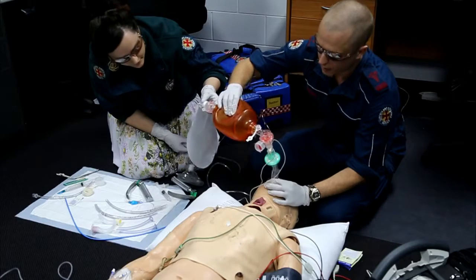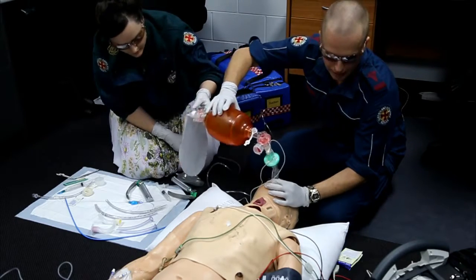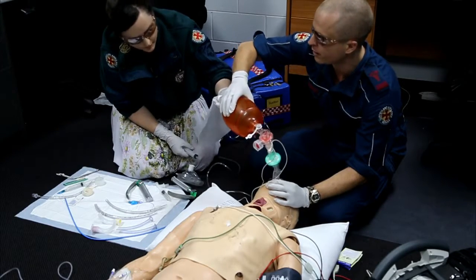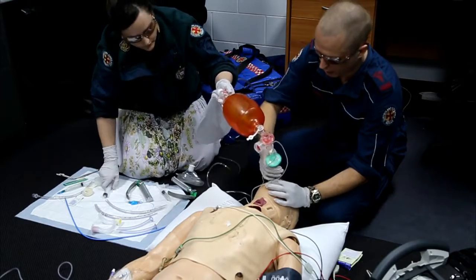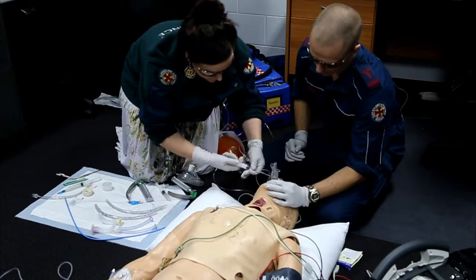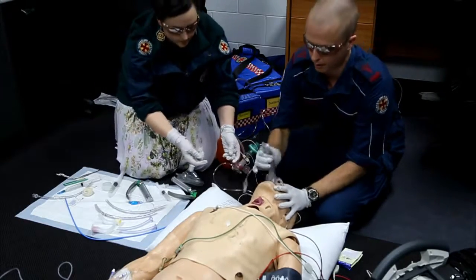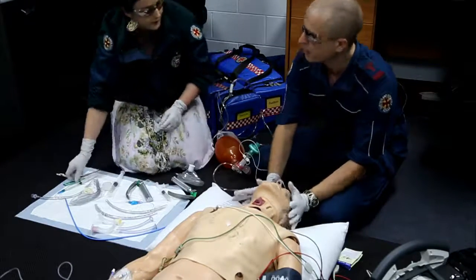Okay. So for the point of the exercise again, we've got no rise and fall of the chest, it doesn't feel right, and we've got no end-tidal CO2 waveform, so we're going to have to proceed straight to a surgical airway. Okay, so can you deflate? Deflated. Okay, pull that. Okay, so now we'll do a surgical airway.